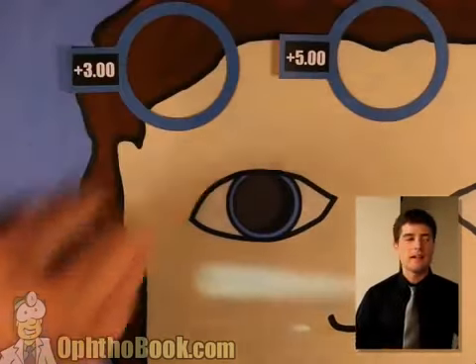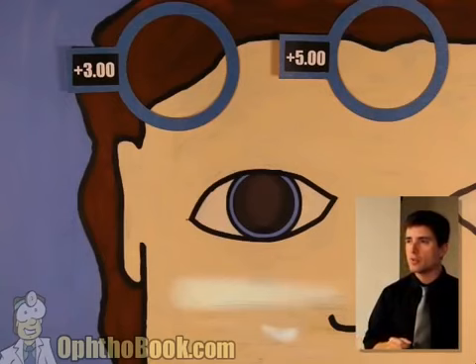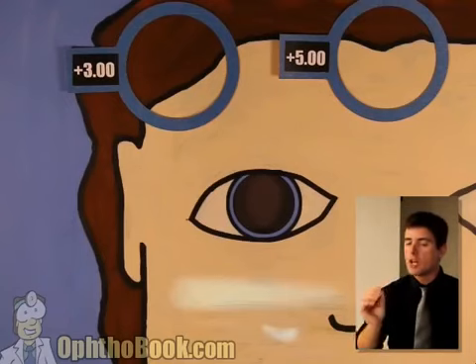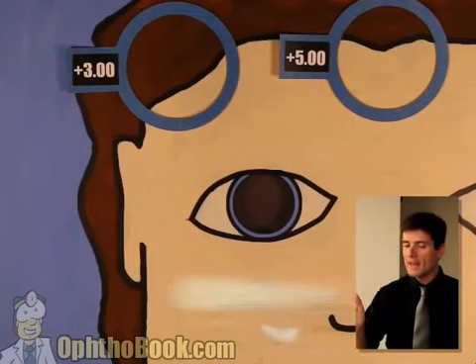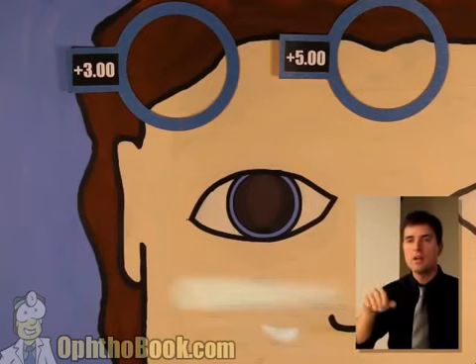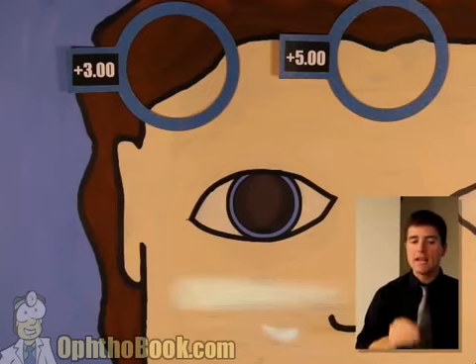Set the lenses aside, and now you can start thinking about the numbers and writing these things down. So this prescription is what? It's a +3 +2, it's the difference between them, and the axis, we can just look at where our light beam is oriented right now. It's going sort of horizontal. We know the axis is at 180. So the answer is a +3 +2 at 180.